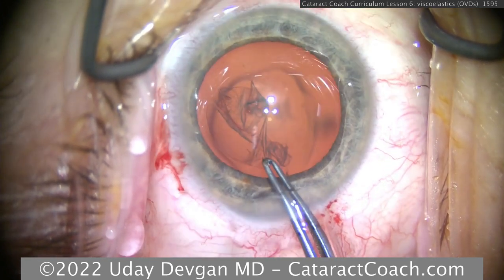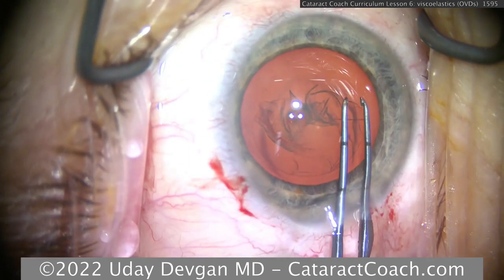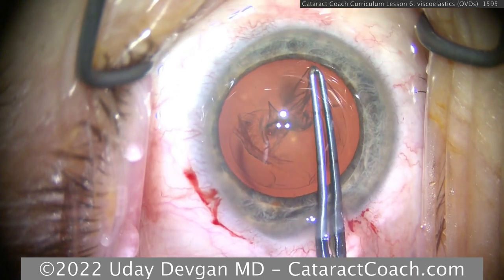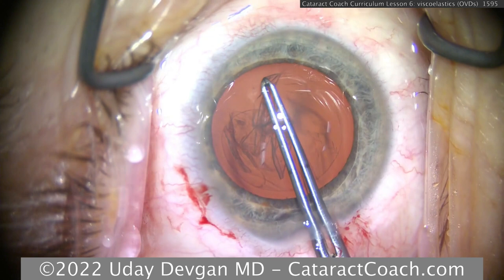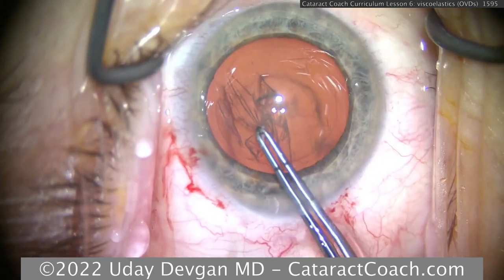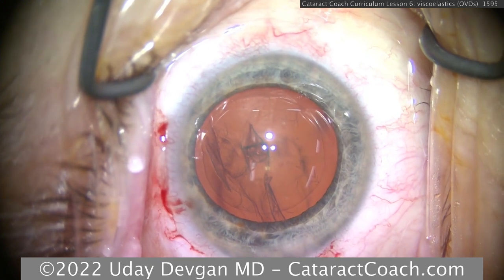The soft shell technique can be used in cases where you want the benefit of both a cohesive and a dispersive. So by using the two agents here, we can achieve multiple qualities at once. So endothelial protection as well as good space maintenance by the cohesive.